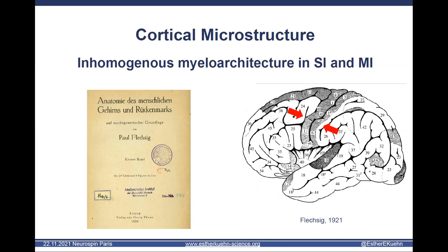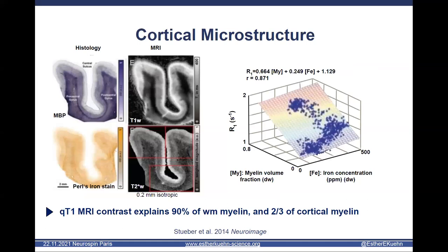And interesting with respect to the sensory motor system is that, as you may see here, the model is very different from the model that we have in our minds, where usually we parcellate the sensory motor cortices from superior to inferior into stripes: area 3b, area 1, area 2, area 4. But here there were divisions dividing the system into inferior and superior parts, something that we usually don't do in our models of the brain. So we wanted to see how we can describe those systems using novel methods of in vivo myelin mapping, using the high field images and the high resolution available.